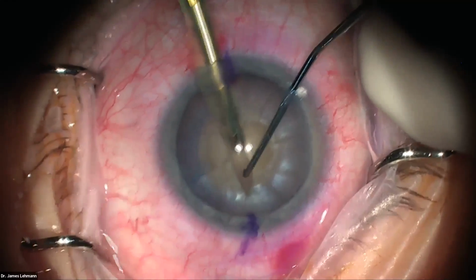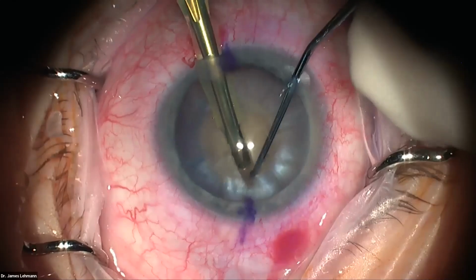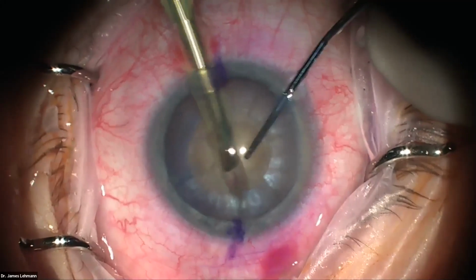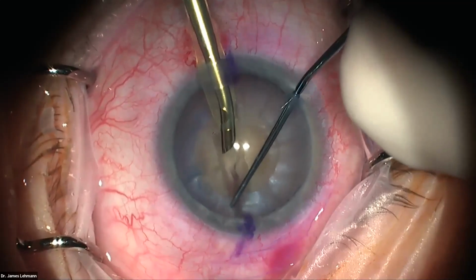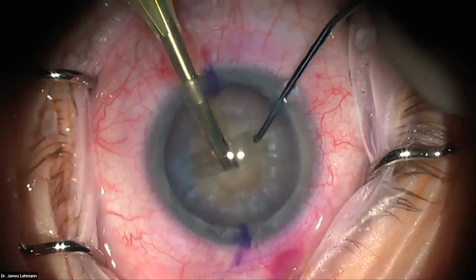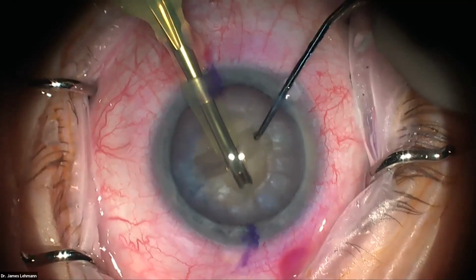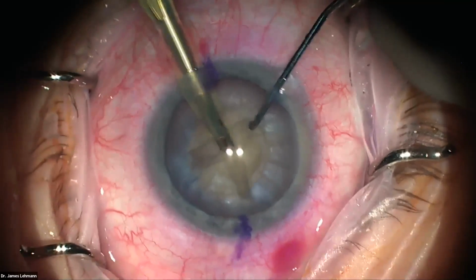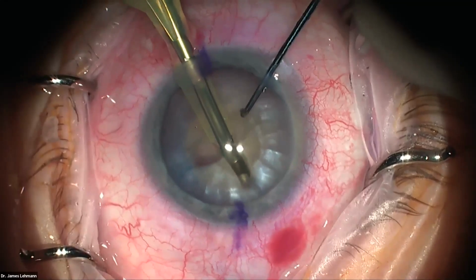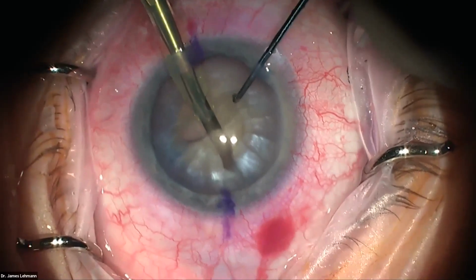Try to keep that center for y'all. It cracks pretty easily. And then I'm just going to remove some of that liquefied stuff. And then look how easy it is to rotate. Remember, I didn't really do any decent hydrodissection, and it rotates easily. So now I know the depth that I need to go for these, right? That's the easy part. Once you have the first crack, you know how far down you have to go, basically as far as the first one.